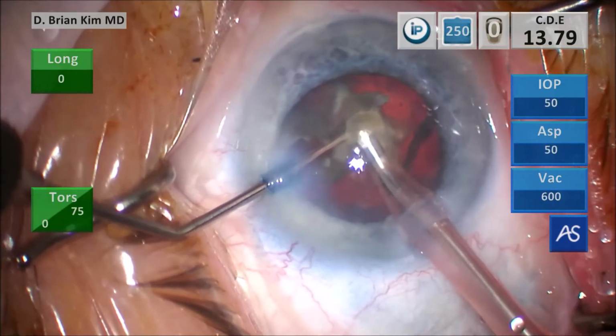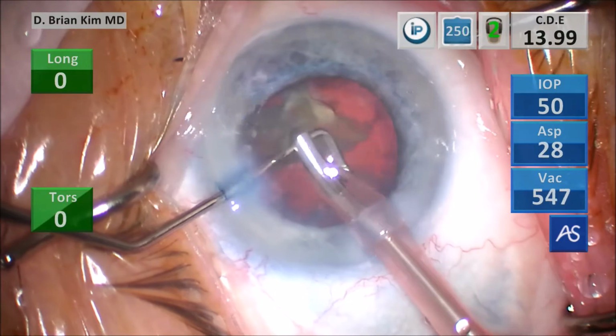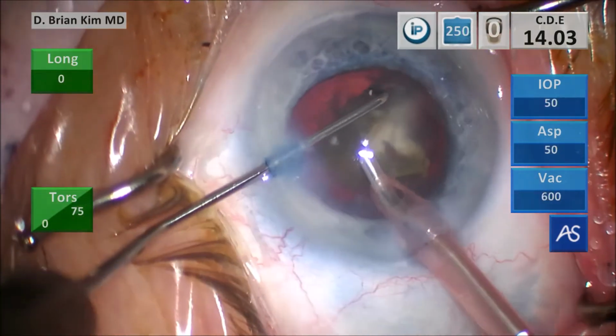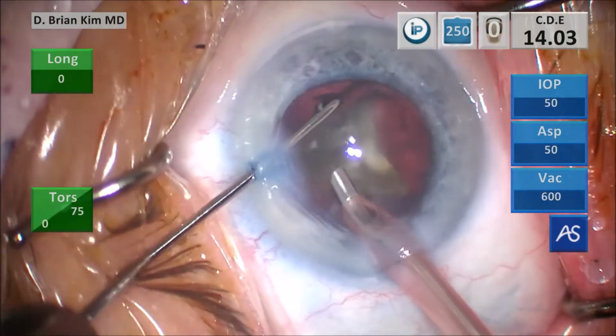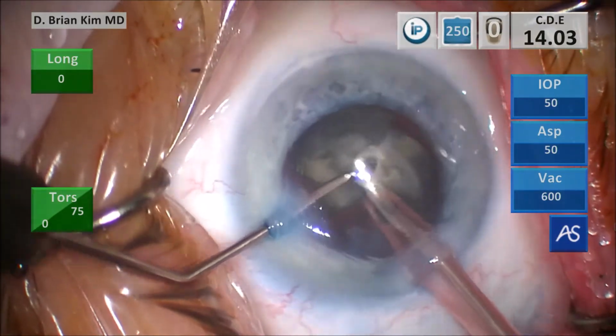By hooking the lens with the chopper peripherally, you're just pulling it up towards you, which makes a lot of sense because it's stuck within the bag. So just use a chopper, get around the lens, and then now you have opposing forces, and you can crush the lens very efficiently between the instruments.